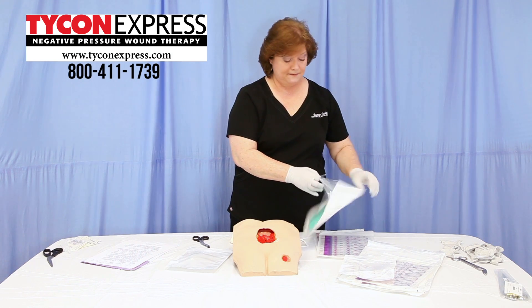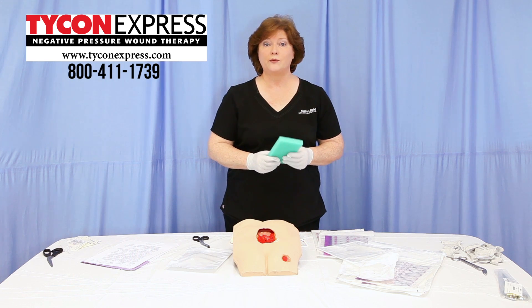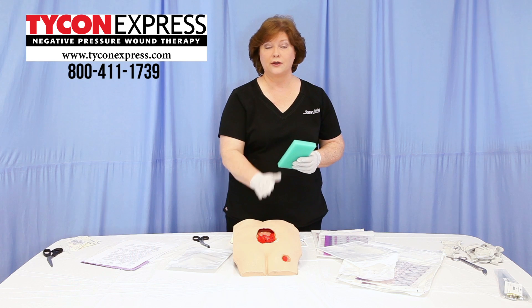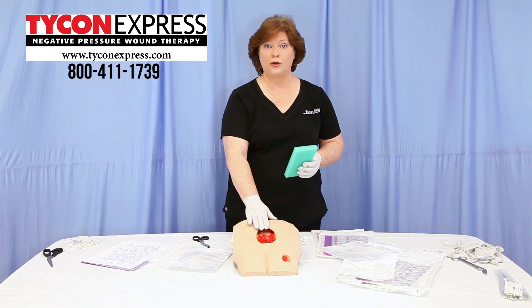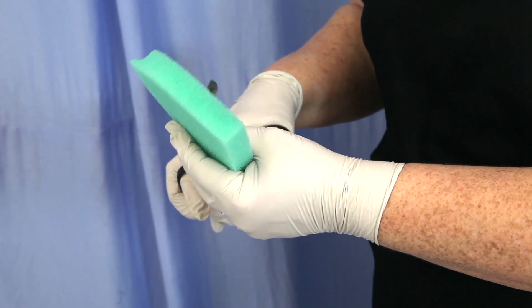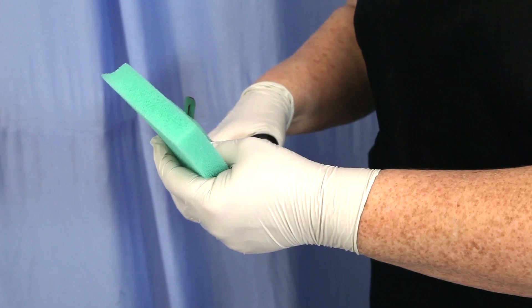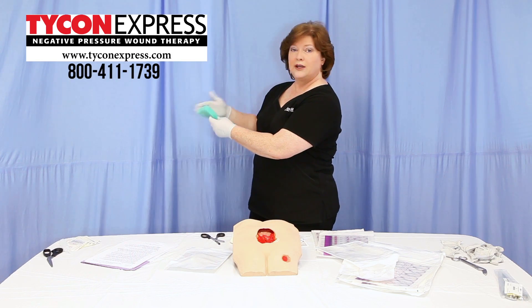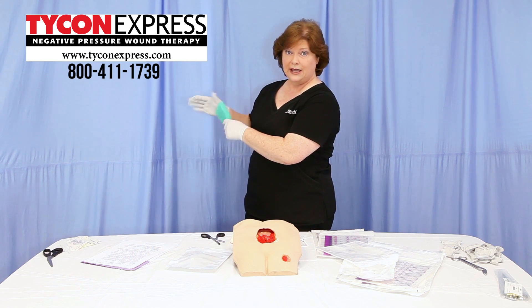You will cut the dressing to fit, and when cutting any foam dressing, please assure that you do not cut the dressing over the wound bed to assure that no fragments from the dressing fall into the wound bed. Cut the foam dressing into an appropriate size corresponding to the dimensions of the wound. After cutting the dressing, be sure that you tap away any fragments or residue, holding away from the wound.